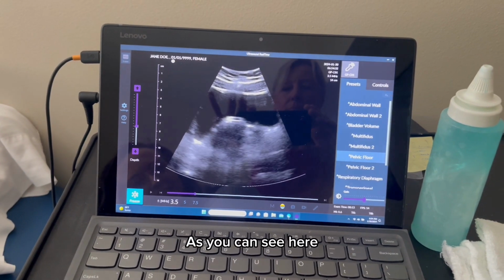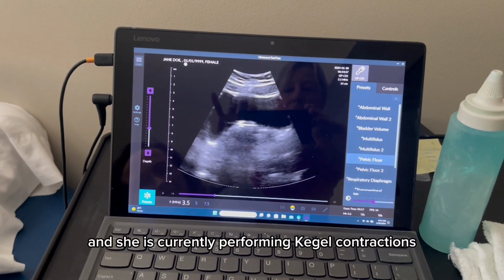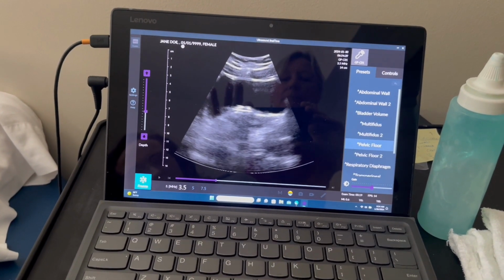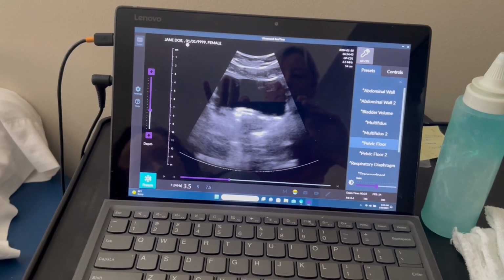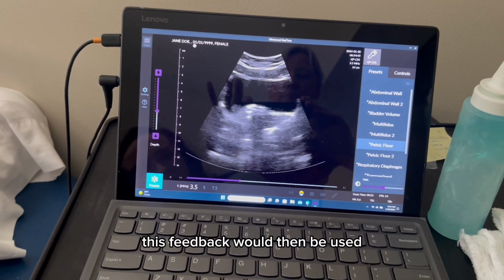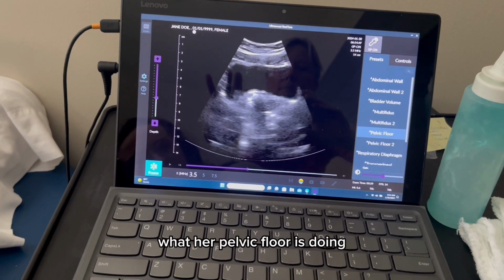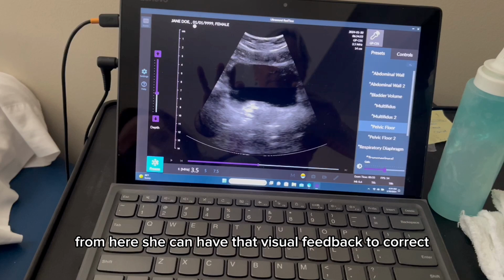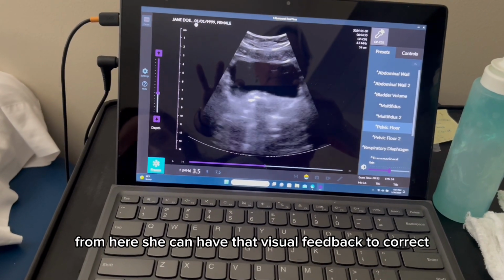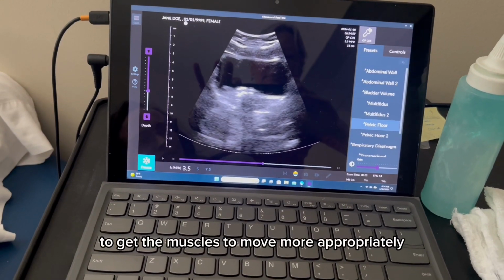As you can see here, this is a patient's pelvic floor, and she is currently performing Kegel contractions, so we can see the appropriateness of her pelvic floor lift and lowering. This feedback would then be used and turned around so the patient can see what her pelvic floor is doing as she is doing her breathing exercises. From here, she can have that visual feedback to correct the quality of her contraction and try to get the muscles to move more appropriately.